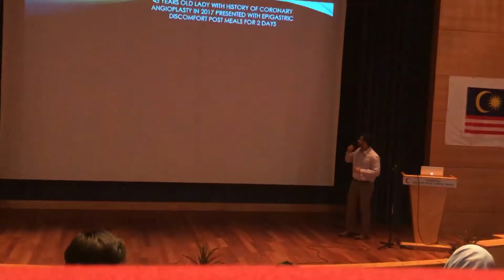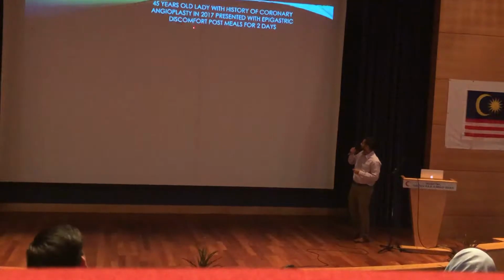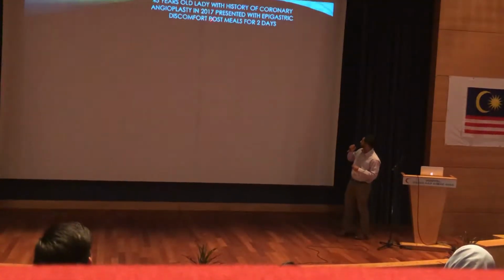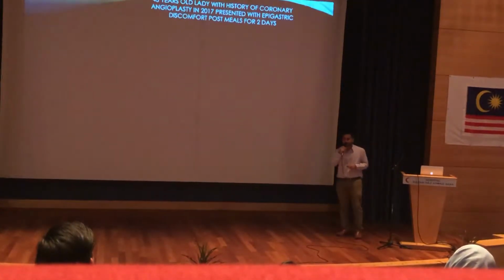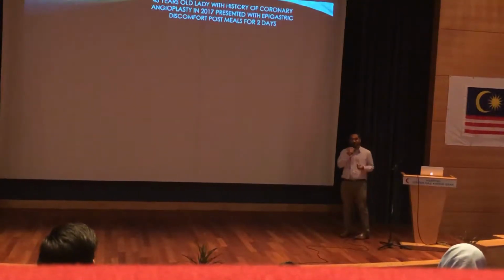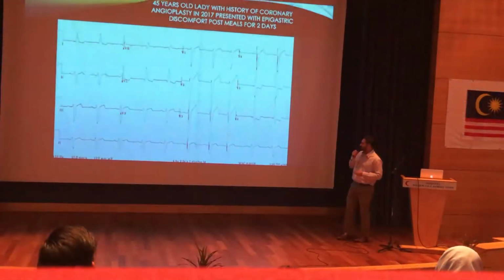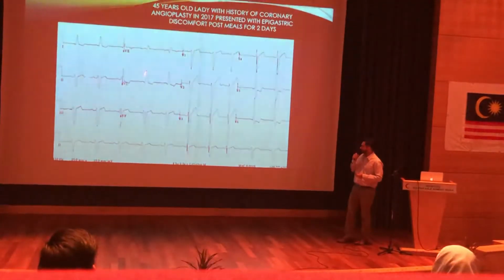Okay? So another ECG that I want to give you. A 45 year old lady, history of angioplasty done just 2 years back, came in with epigastric discomfort. As usual, epigastric discomfort, but the patient has had angioplasty done. So you think ACS. No, the ECG is like this. What do you think is wrong here?